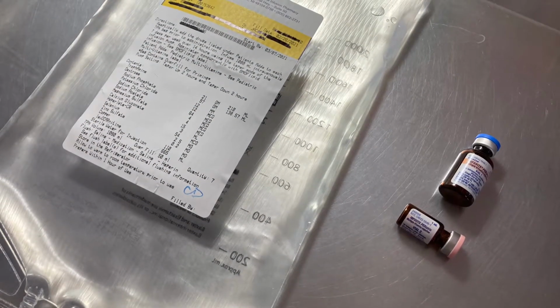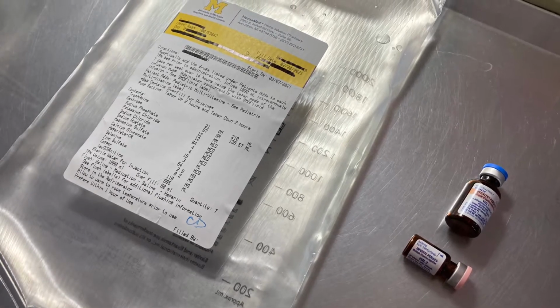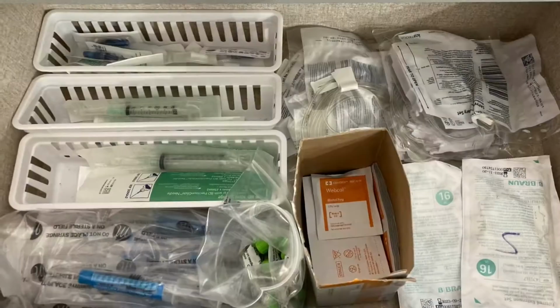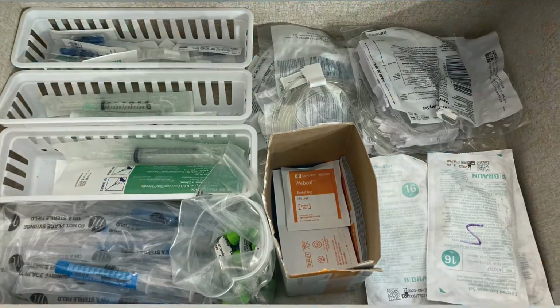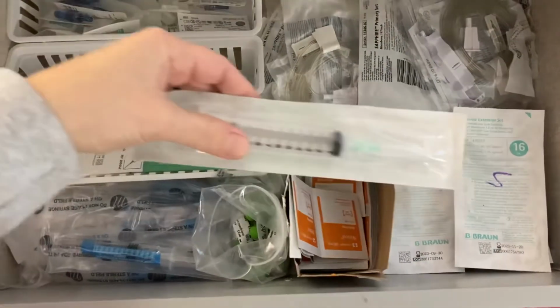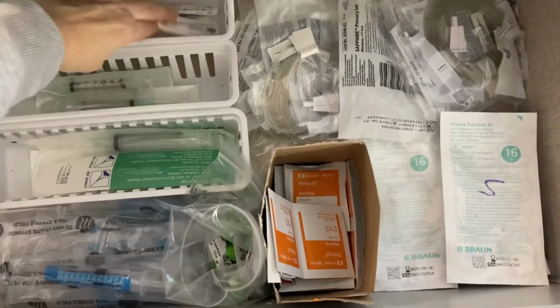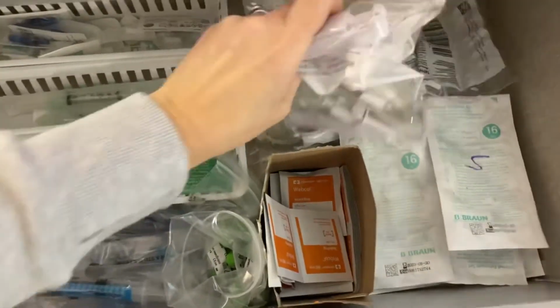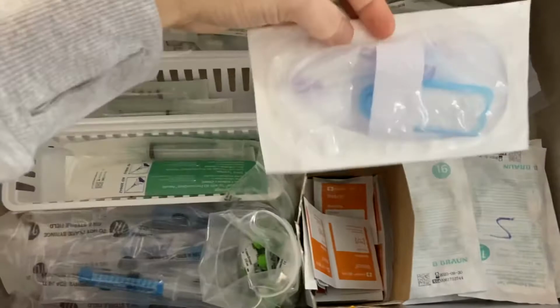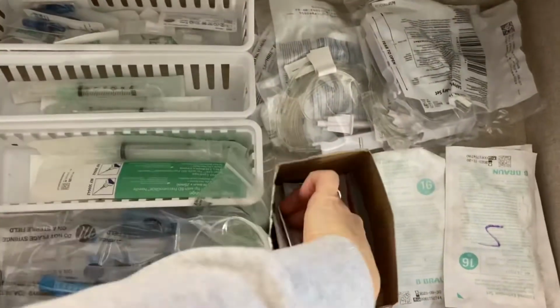From her fridge, grab 1 bag of TPN and 2 vials of vitamins. The bigger one will have a blue cap and the smaller one will have a pink cap. Next, open the first drawer and grab one of almost everything. This will include 1 large syringe, 1 small syringe, 1 anti-siphon valve, 2 bags of tubing, 1 filter that is blue, 1 filter that is clear, and 4 pairs of alcohol pads.